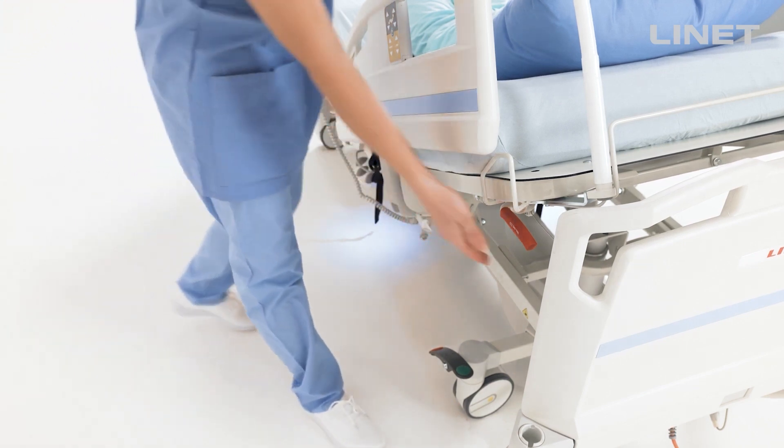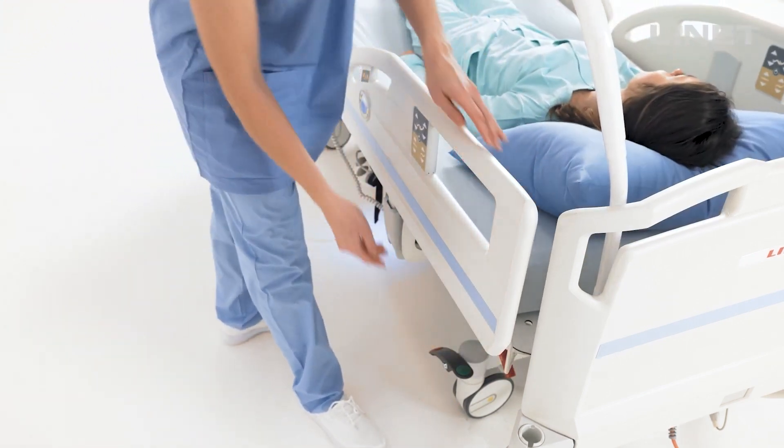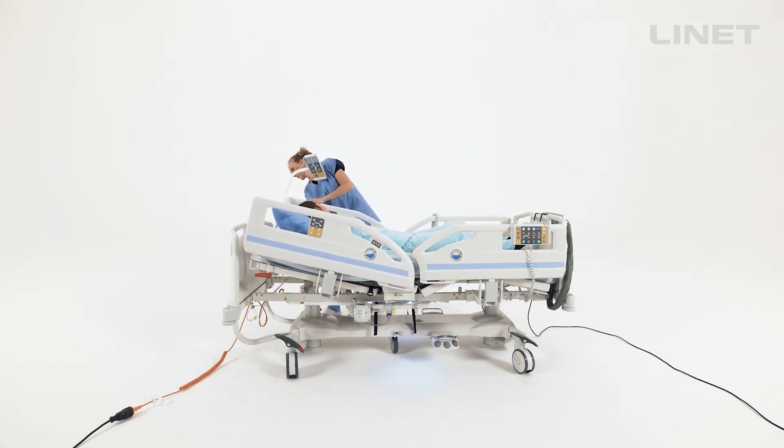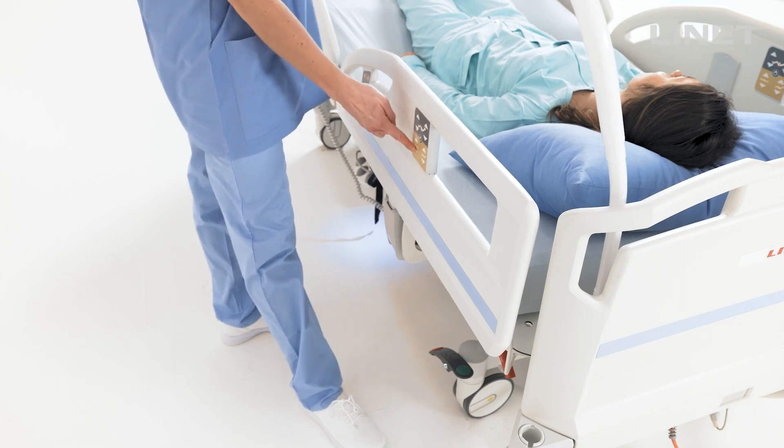The manual CPR handle is located underneath the backrest area. It allows the backrest to go down quickly and smoothly. The lowest position can be set afterwards.